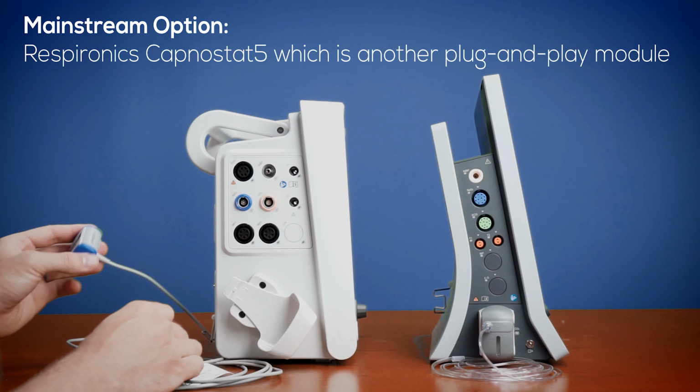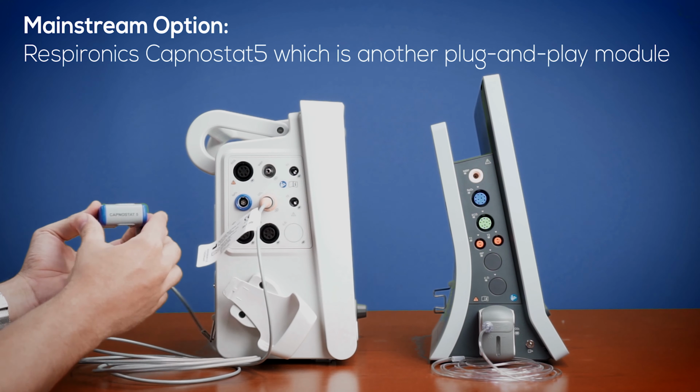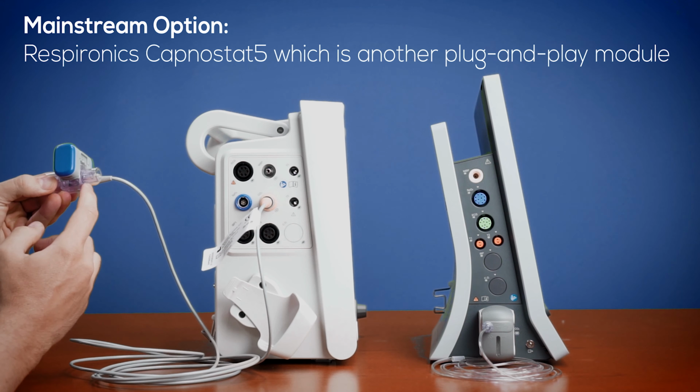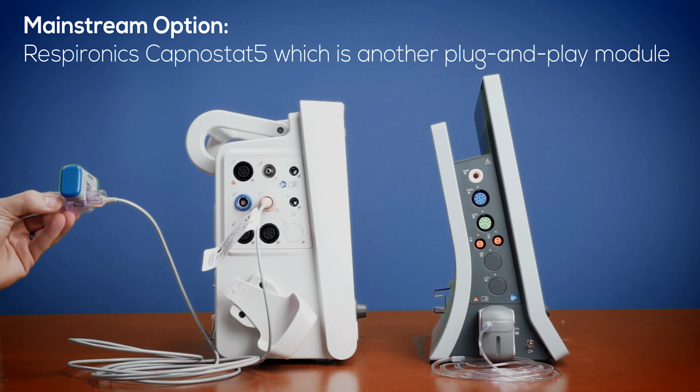The mainstream option is the Respironics Capnostat 5, which is another plug-and-play module. This can use both disposable and reusable airway adapters or a Capnostat mask. This will connect to an intubation tube for intubated patients which are more heavily sedated or need assistance with breathing.